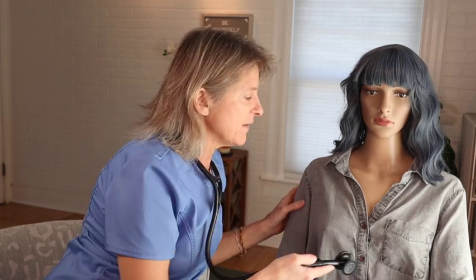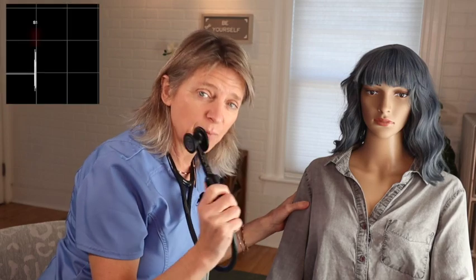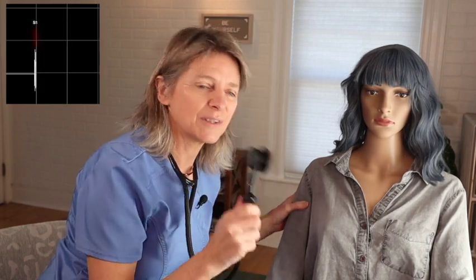Now that we have all of our placement, we're listening for lub-dub, S1, S2, lub-dub, 1-2. If you keep doing that, you're never going to forget it.